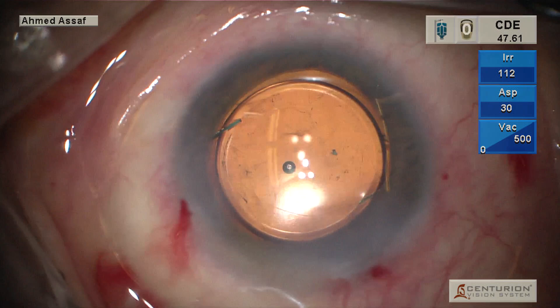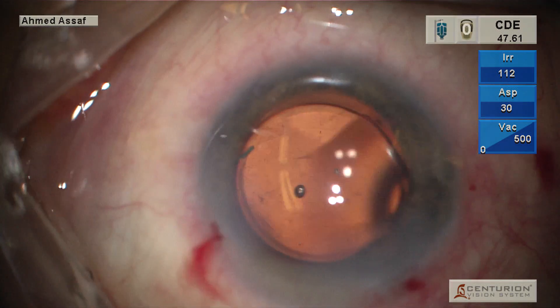You can see that the lens is pretty well-centered, thanks to the optic capture.